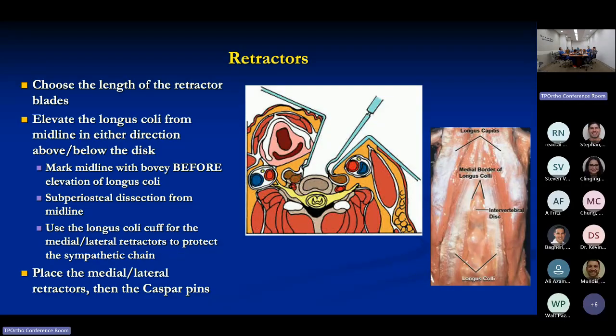Especially with multi-levels, you're more sensitive to just having it strategically positioned, to be honest. So they actually are placed a little more like you will for a disc replacement. In the old days, we would put the pins in essentially a little bit divergent, and then as you distract, maybe create lordosis. The reality is, if you do the discectomy and the release and the trials and the cages now, we try to use typically more lordotic cages than we used to, and it tends to be less of an issue than when we were using neutral allografts and things like that.